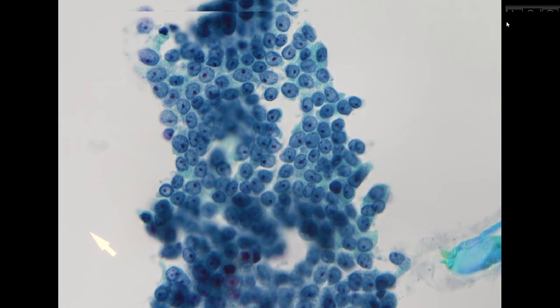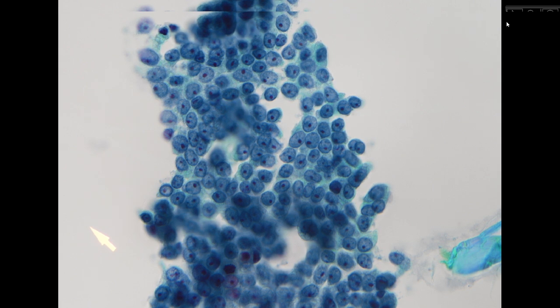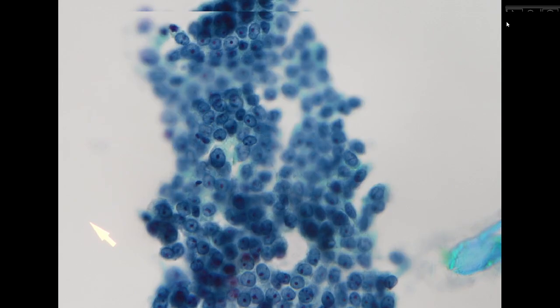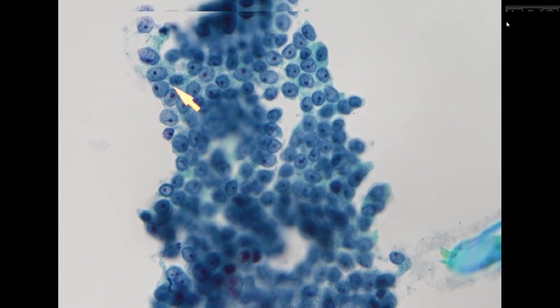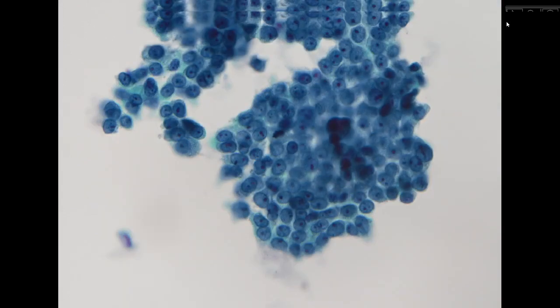Particularly, this could be one of the only clues that we can appreciate when it is a well-differentiated adenocarcinoma. In this case, we clearly have a drunken honeycombing arrangement. You can appreciate these two nuclei are very close, but these are distant apart. Additionally, each of the cells has very prominent nucleoli. So this is consistent with an adenocarcinoma. This is another case of pancreatic adenocarcinoma.